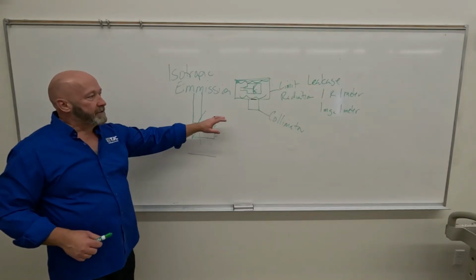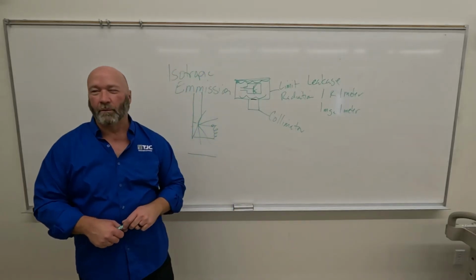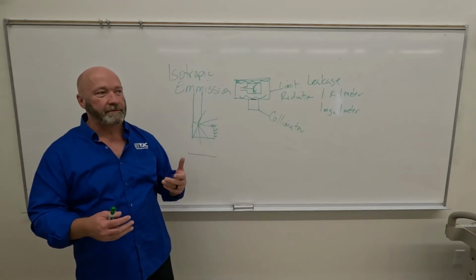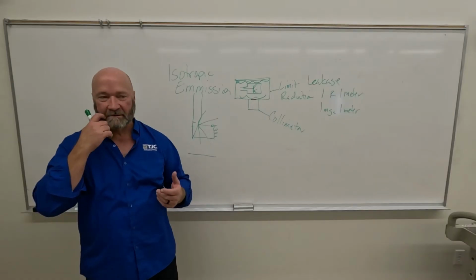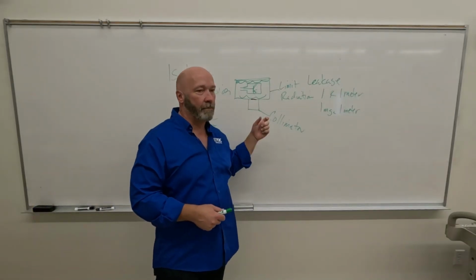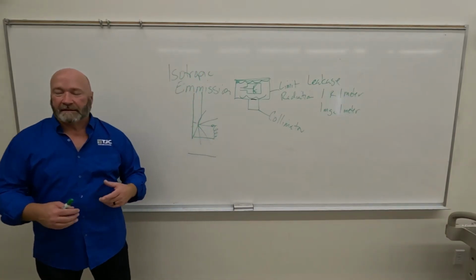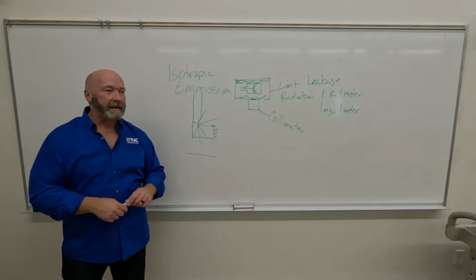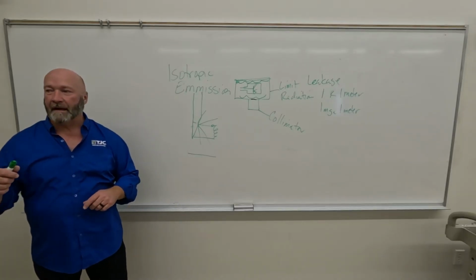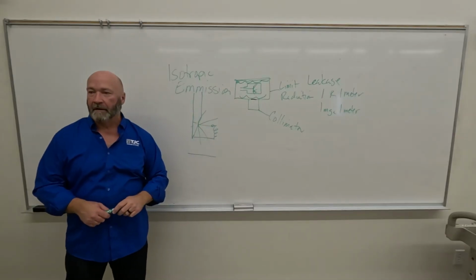All right, sometimes though, in addition to the leakage radiation, I've only seen this once or twice, but sometimes we may have a mechanical breakdown of the protective housing. What I mean by that is, it's not really mechanical, it's pretty static, but we may have a loss of integrity of the protective housing itself.